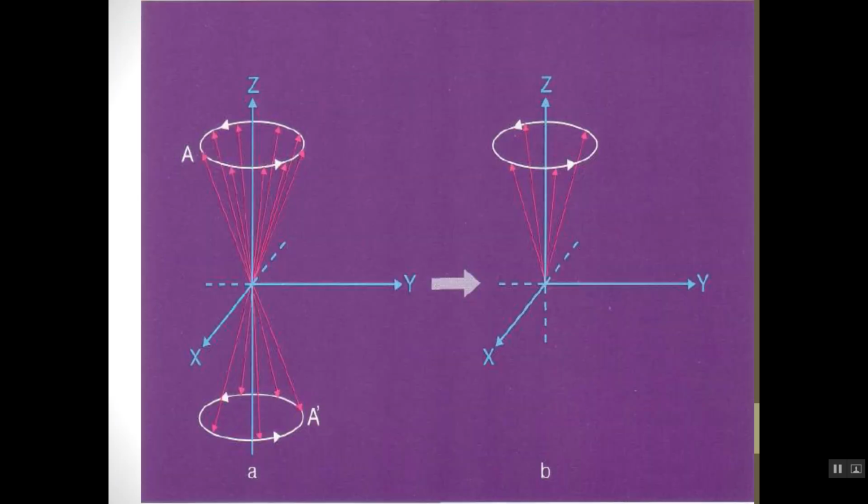So now I have some protons aligned up in the z direction. The protons here are aligned with the main magnetic field. Each one has a certain magnetic moment. So the protons here in the z direction add to and increase the magnetic force in the z direction.